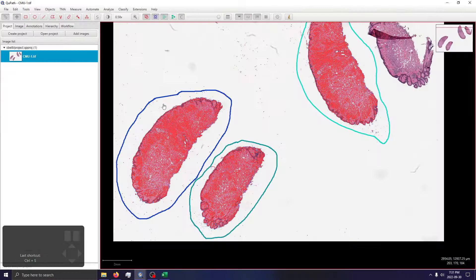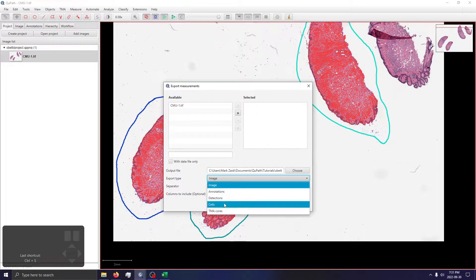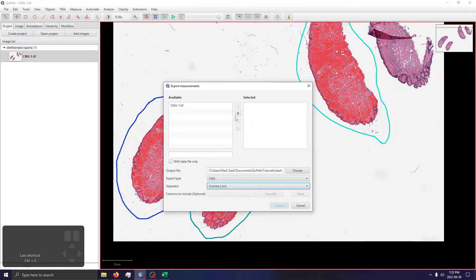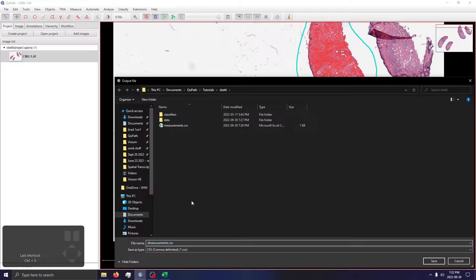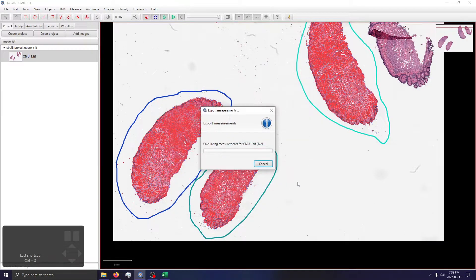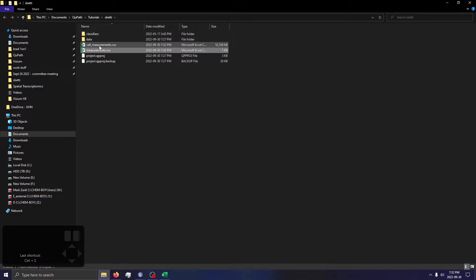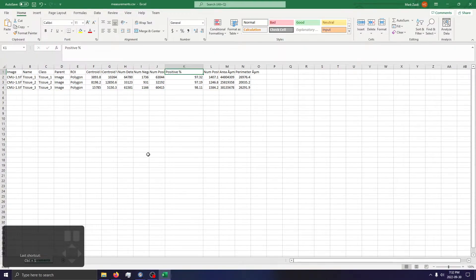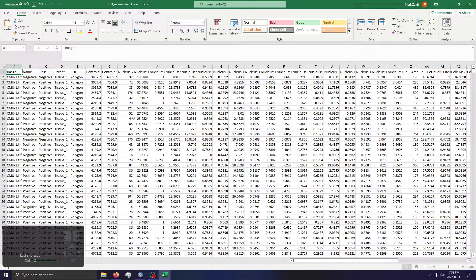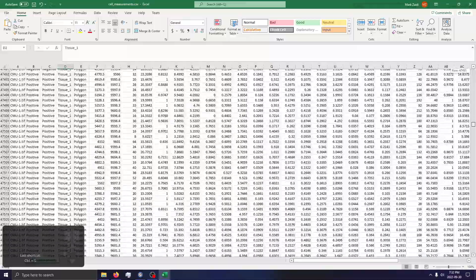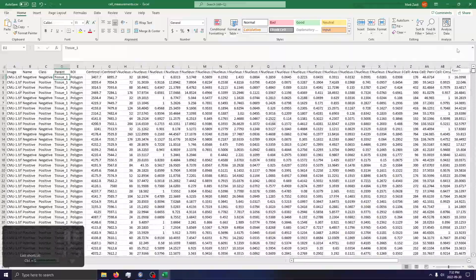Let me do a cell-level export — I'll call it cell export — it won't take too long. Done. Now I'm going to open this in Excel, which of course is not the ideal platform for opening large multi-megabyte or gigabyte files. But as you can see, every single row corresponds to a single cell, and the parent — tissue one, two, or three — can be used as a categorical variable to identify in which of your multiple tissue sections on a slide that cell came from.